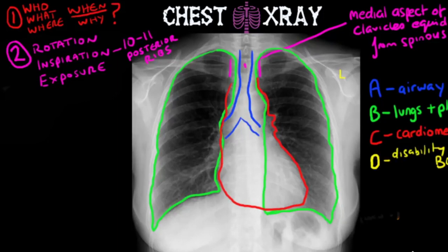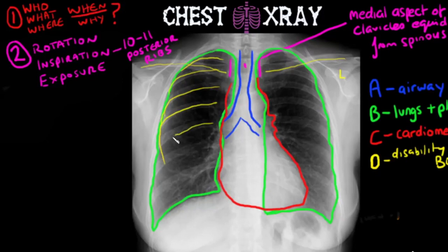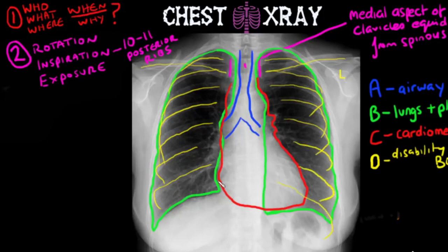Staying true to the ABCDE mnemonic, D stands for disability, which incorporates bones. You are going to try to trace the clavicles, look at the spinous processes in the midline, and then work on the ribs — starting at the top and working your way down, beginning at the posterior aspect and working forward, looking for fractures or any displacement. Any fracture or displacement could imply damage to underlying structures.